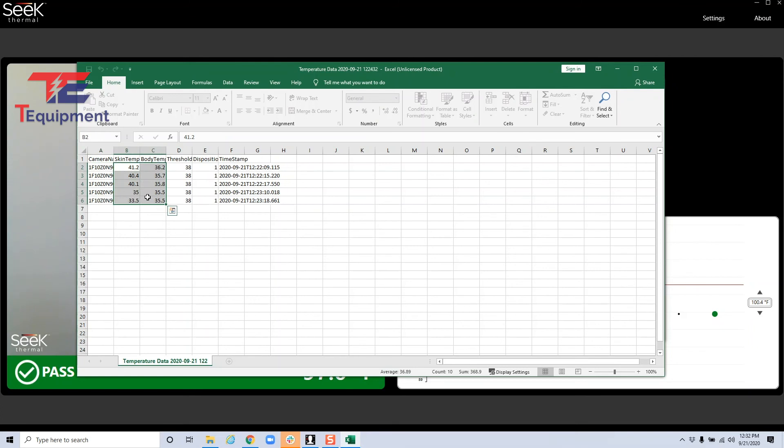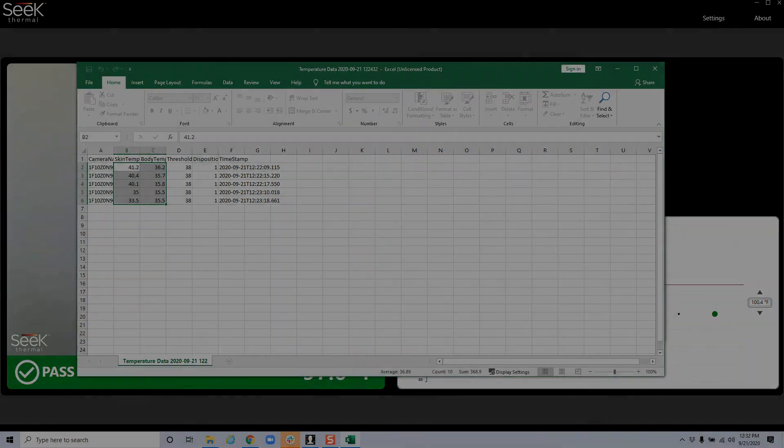And this is in Celsius, so you'll have to convert this to Fahrenheit to be able to see the equivalent. However, you have all the data available for export here.